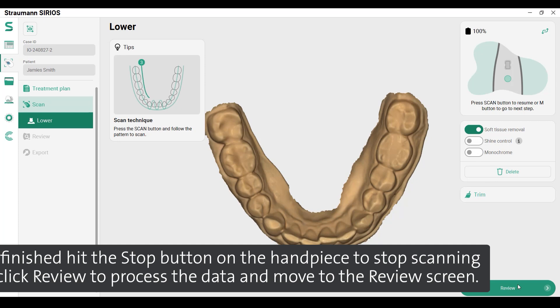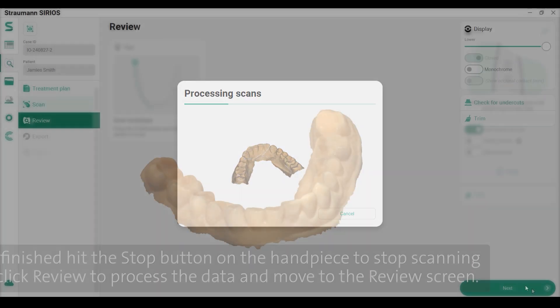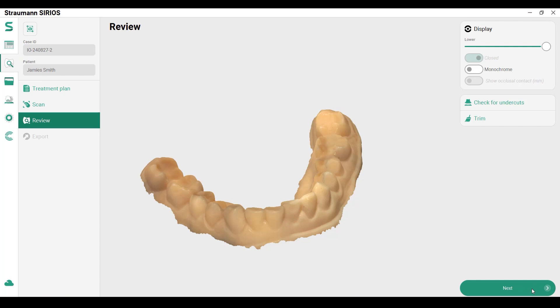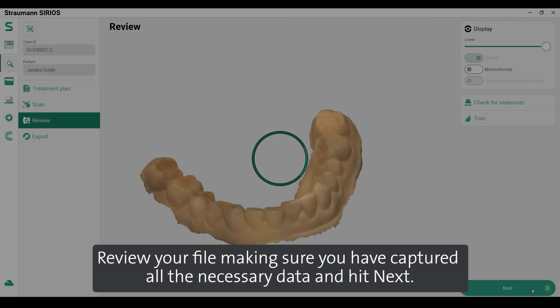Once finished, hit the stop button on the handpiece to stop scanning, then click 'Review' to process the data and move to the review screen. Review your file, making sure you have captured all the necessary data, and hit 'Next'.